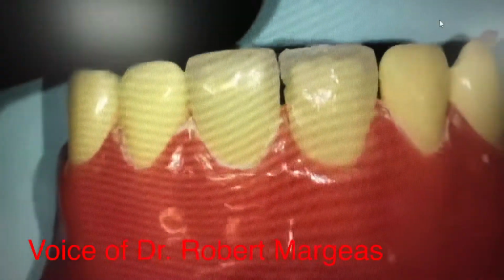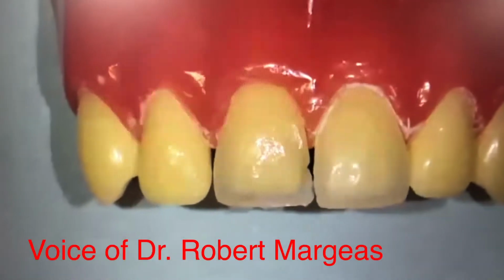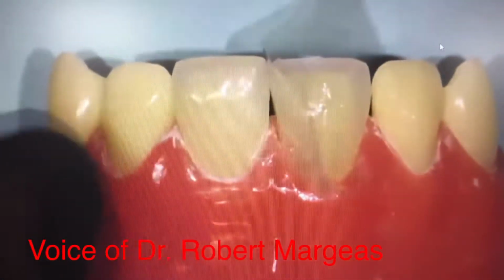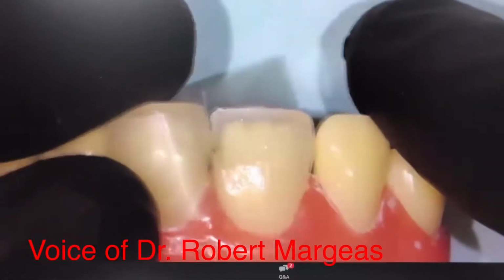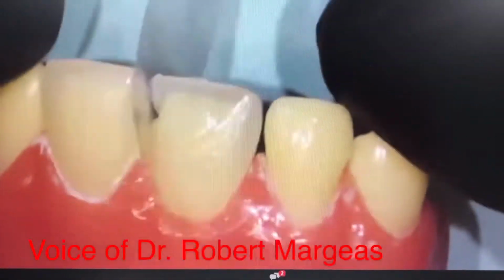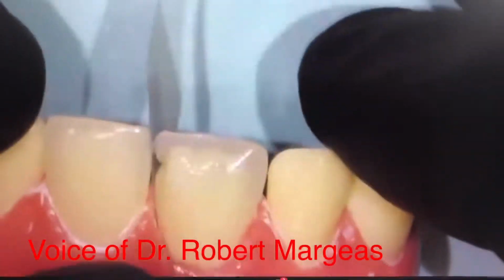But try to take your time. You don't need a lot of material. It's very, very thin material. Then I want to show you how we create the translucency. Okay? So that's what we're looking at right here. Have the dentin shade on. What I've done is I put a mylar strip in between the teeth, because this is going to be my first pull-through technique, okay? What I want to do is protect that incisal translucency. I want to have material that goes in between those lobes.